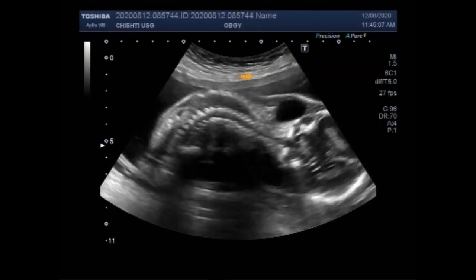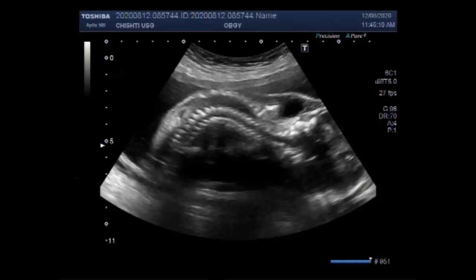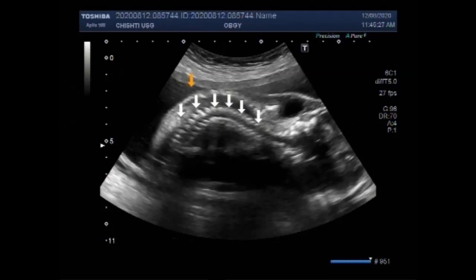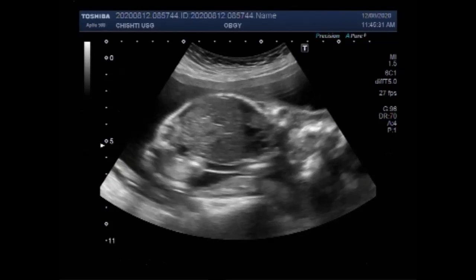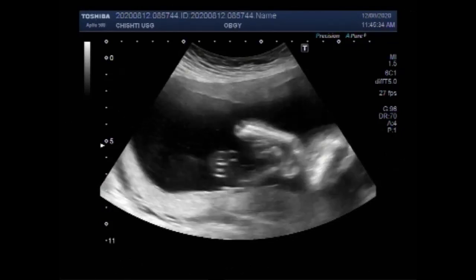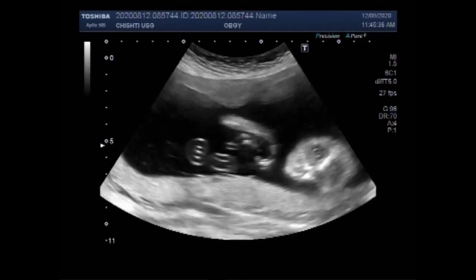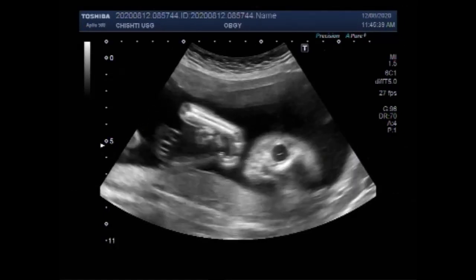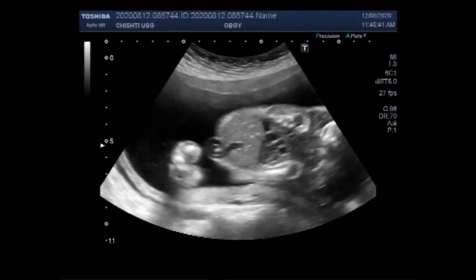Now you can see the kyphosis of the spine. Kyphosis is a spinal disorder in which an excessive outward curve of the spine results in an abnormal rounding of the upper back or neck.